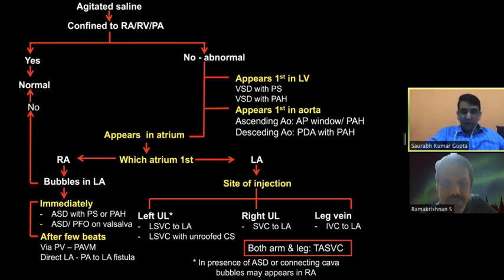I shared with you experience from more than 1,000 patients in different settings, and PFO is a condition which is seen in almost 20 to 25% of the population. People have been doing saline contrast echo as well as transcranial Doppler in these settings, and they haven't found any difficulty. And in our own experience, cumulatively, I think we would reach 1,000 among ourselves in the department, and we haven't found anything of that nature unless you have been careless in pushing in a large bubble which can trap into the system and create trouble.